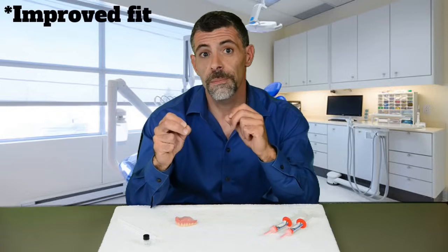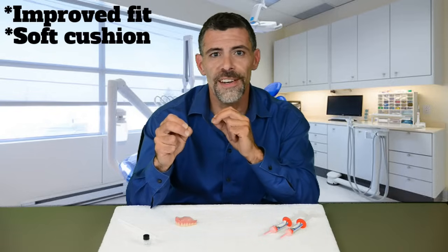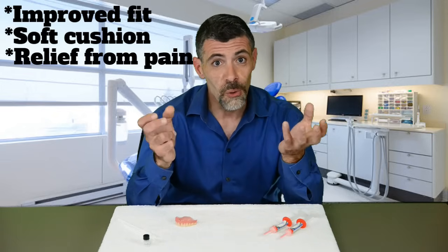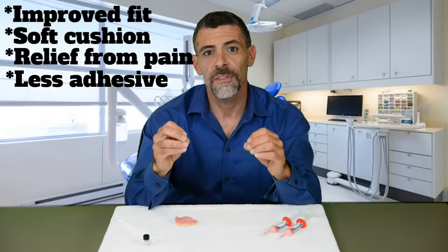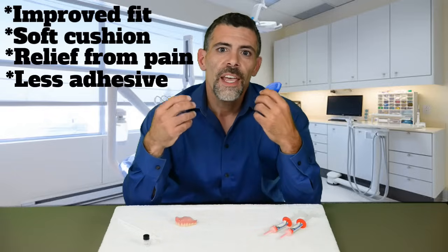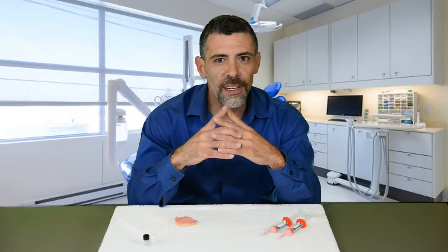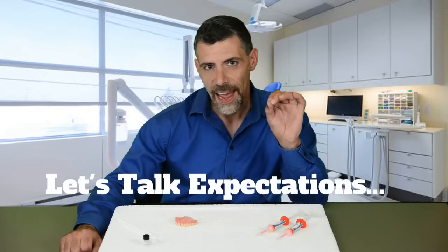So knowing that, how will Denture Fit work for you? Number one, you'll have a much improved fit. Number two, there will be soft cushioning against your hard dentures. Number three, you'll have relief from denture soreness. Number four, you will reduce or eliminate the need for that yucky adhesive. So if you have an ill-fitting denture that has no suction, Denture Fit will improve the stability and comfort of your denture.